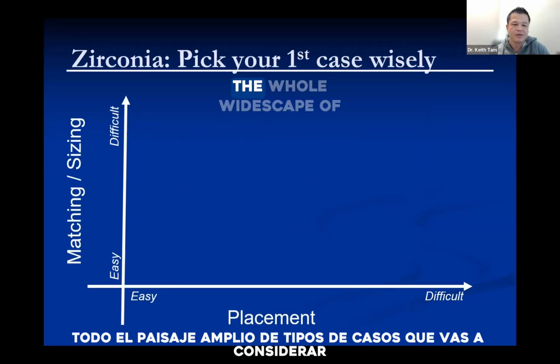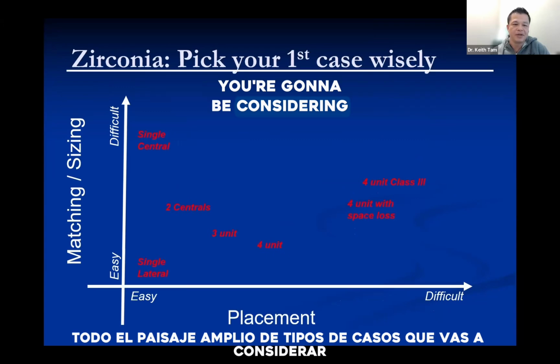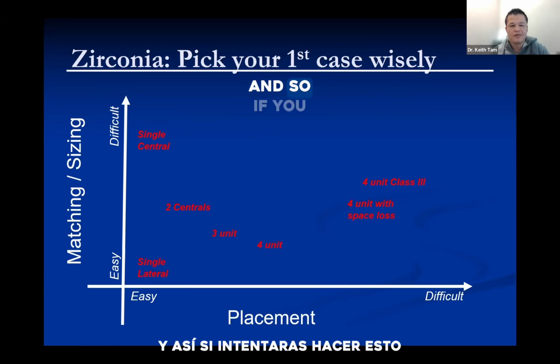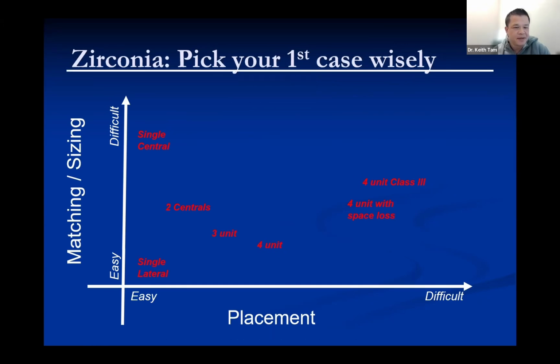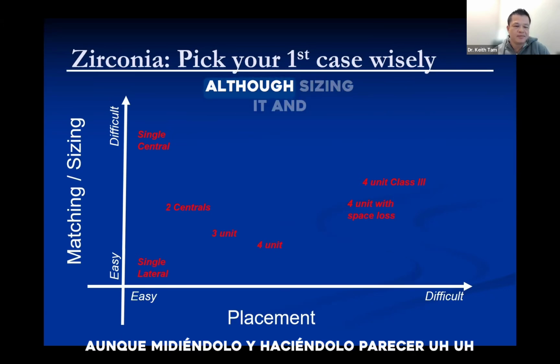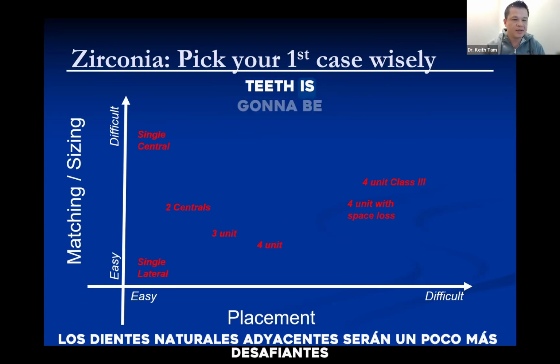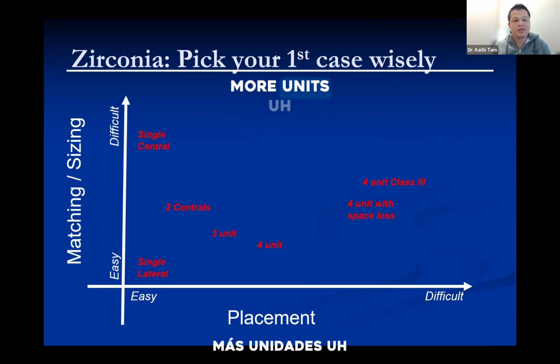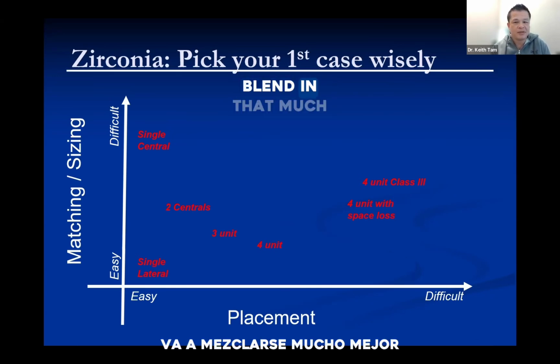If you look at the whole wide scope of the types of cases you're going to be considering, obviously anteriors are going to be far easier than anything in the posterior. And so if you were to attempt to do this, I think a single lateral or single central would be great, although sizing it and making it look like the adjacent natural teeth is going to be a little more challenging once it's a single unit. But as you get to more units, it's going to blend in that much better.